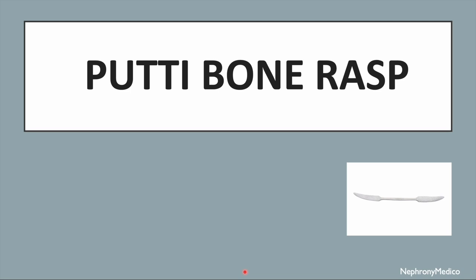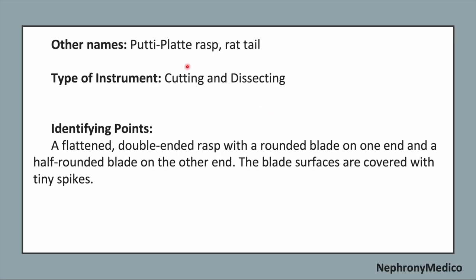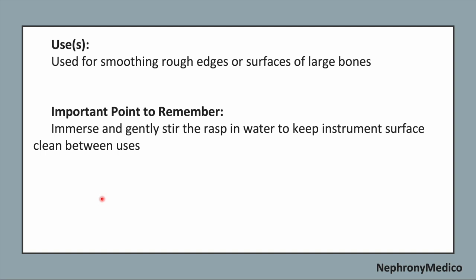Let's talk about Putti bone rasp. This is a picture showing Putti bone rasps. It is also called Putti plate rasp and rat tail. It is a cutting and dissecting type of instrument. Now, identifying points. A flattened double-ended rasp with a rounded blade on one end and a half-rounded blade on the other end, and the blade surfaces are covered with tiny spikes. Use. It is used for smoothing the rough edges or surfaces of large bones.